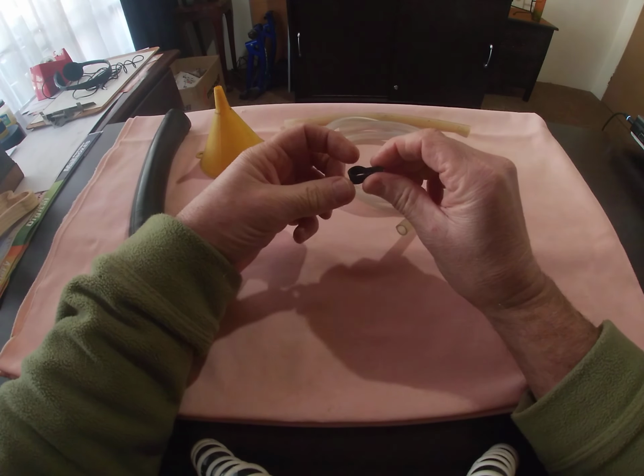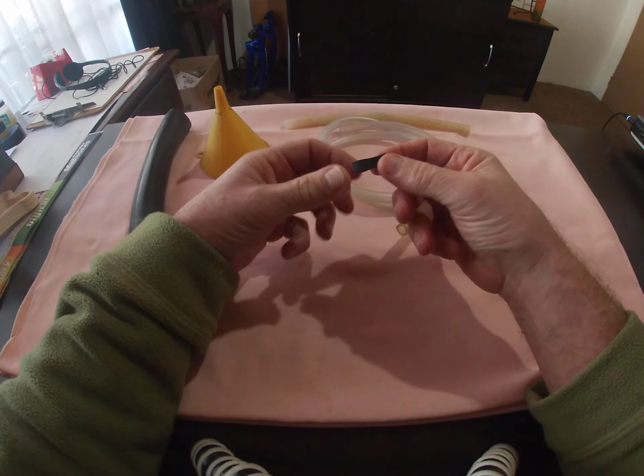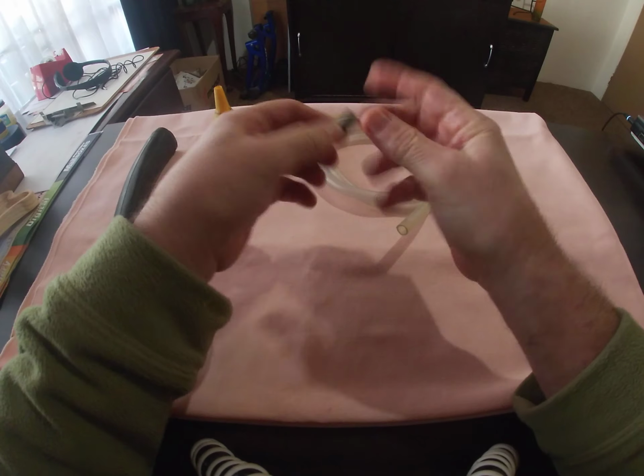And here I've got a smaller piece of tubing. This is from a pedal racing bike tube. You'll see the difference there. And you only need a small piece, like a snippet or so.